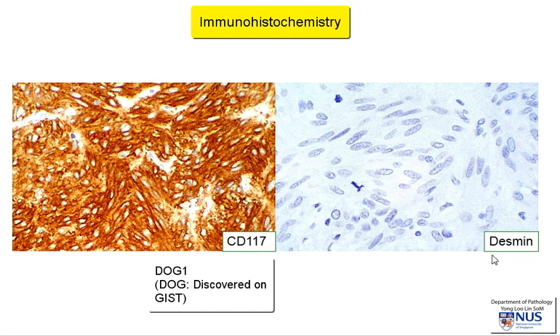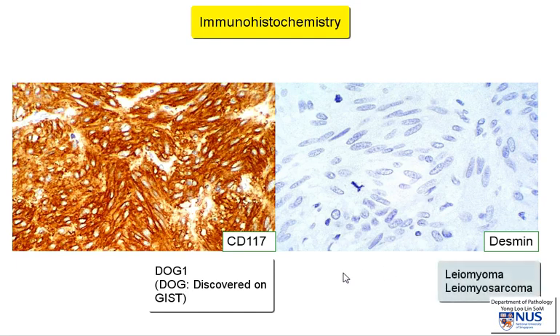In contrast, you can see here this other stain known as Desmin. This antibody is actually negative in GISTs, but it's positive in smooth muscle tumours such as leiomyoma and leiomyosarcoma. So this is how we tell them apart and make the diagnosis on microscopy.